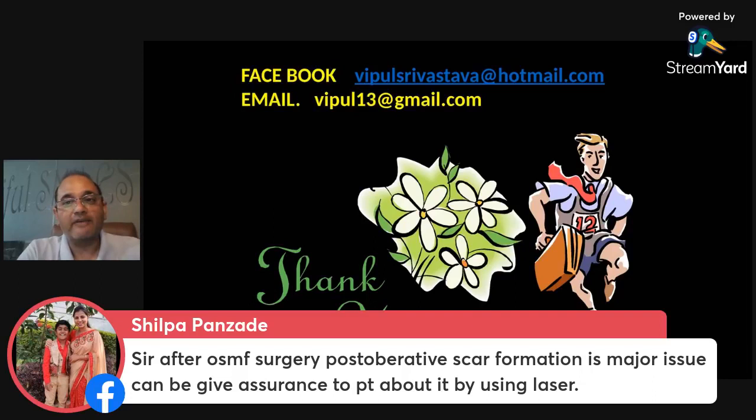So even with the laser, first of all, I suggest using a thick tip. Laser comes with different tip sizes, 250 micron, 300 micron, 330 micron, 400 micron. So many sizes are there. Always go for a thick tip. Also, instead of going into one straight line, give multiple slices so that you are covering more area and they don't get approximated together.